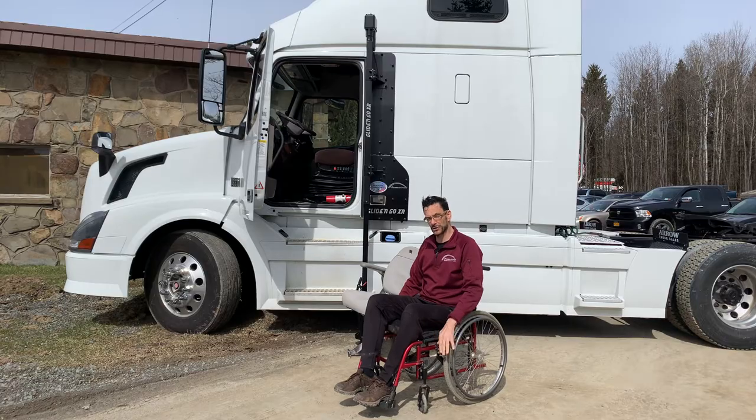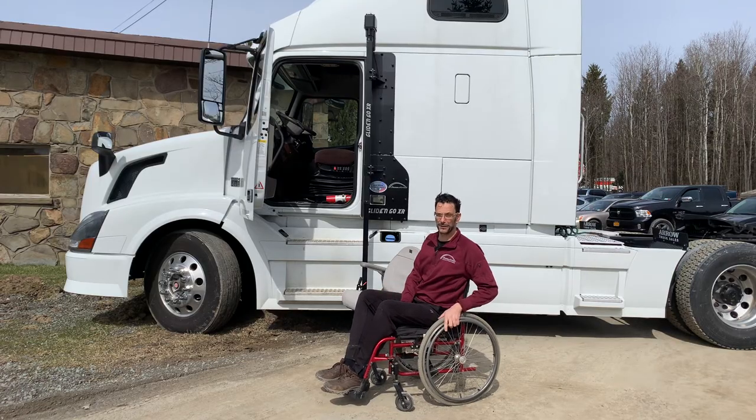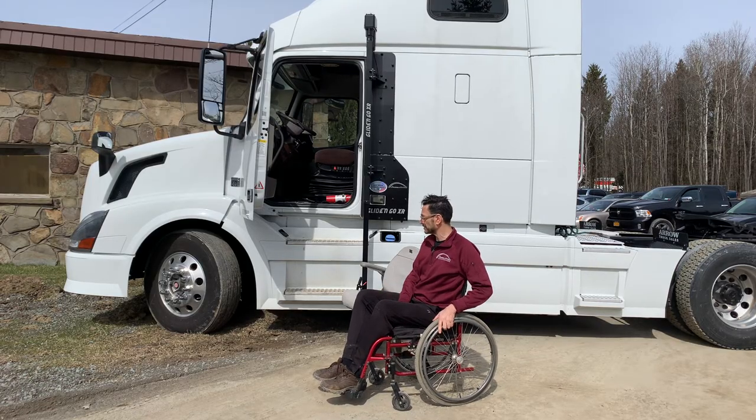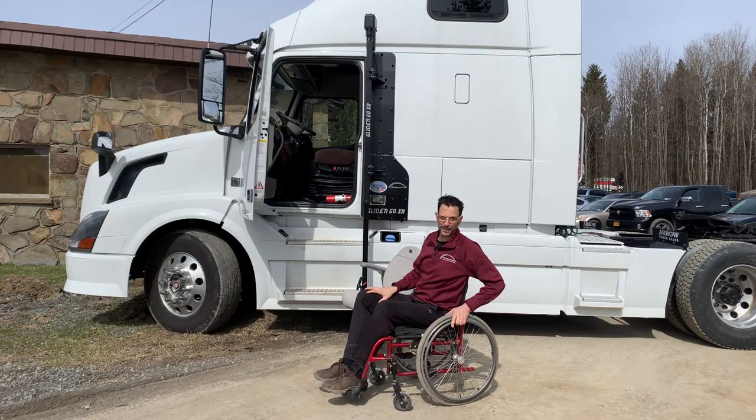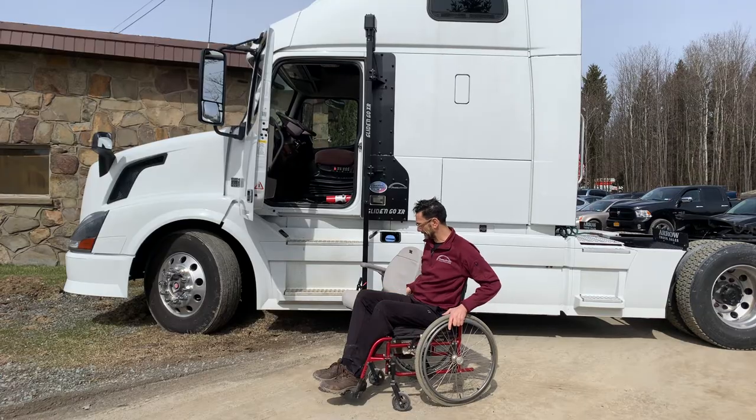Today we're going to show you how to do it leaving the wheelchair down below, and we have another video in the notes that you can check out showing how to do everything and stow the wheelchair. A lot of our users report back that they simply find it easier to just leave a wheelchair inside and have a wheelchair at the start, and then if they need to do an inspection or anything like that, they've got a way to travel around when they get there.